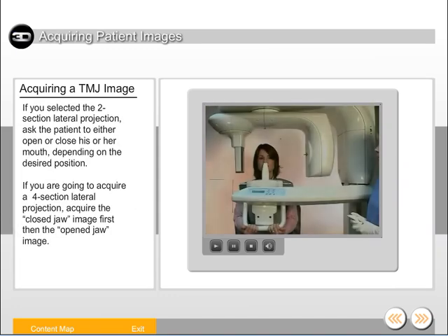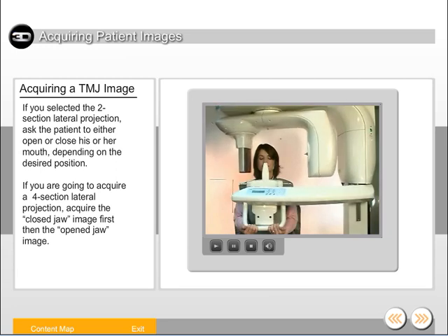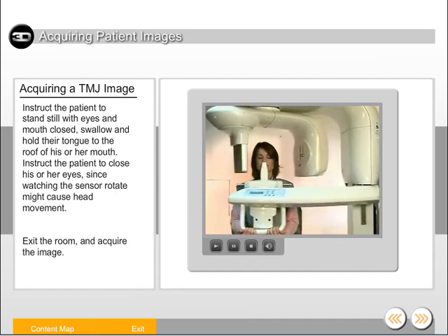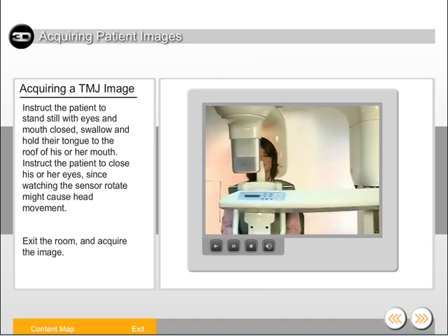If you selected the two-section lateral projection, ask the patient to either open or close his or her mouth, depending on the desired position. If you're going to acquire a four-section lateral projection, acquire the closed jaw image first, then the open jaw image. Instruct the patient to stand still with eyes and mouth closed, swallow, and hold their tongue to the roof of his or her mouth. Instruct the patient to close his or her eyes, since watching the sensor rotate might cause head movement. Exit the room and acquire the image.